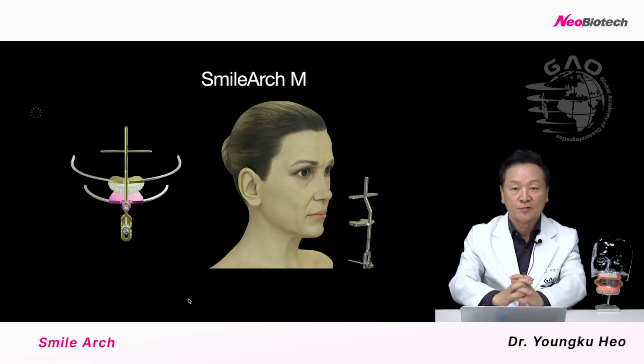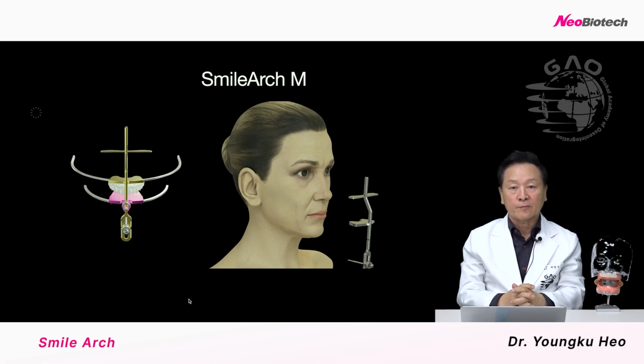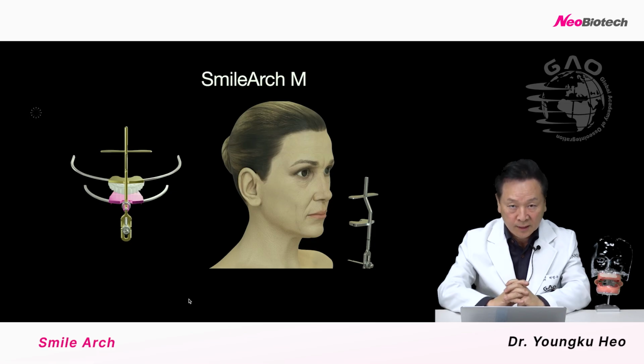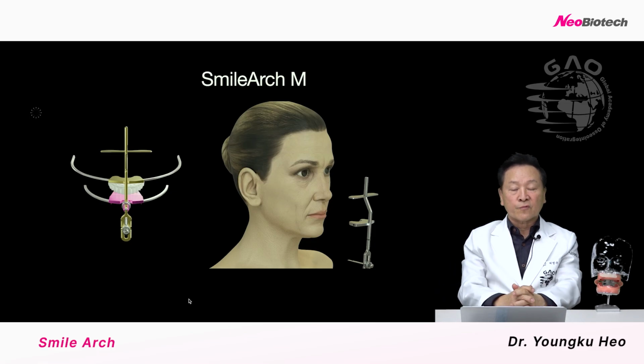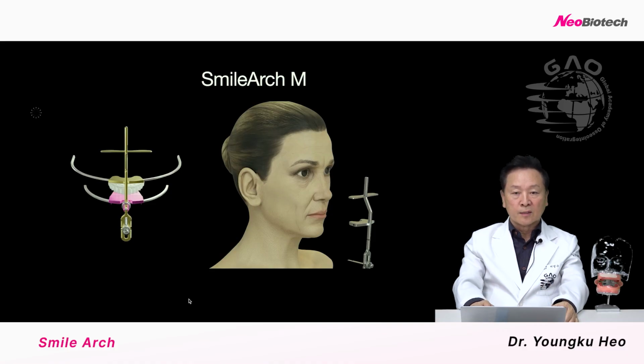I'm Dr. Yongkuho. Very nice to see you here, and I'm very happy to introduce the SmileArch made by the biotech. The SmileArch is for determining vertical dimension and the CR record, and also the smile line, so it's good for making full arch cases.